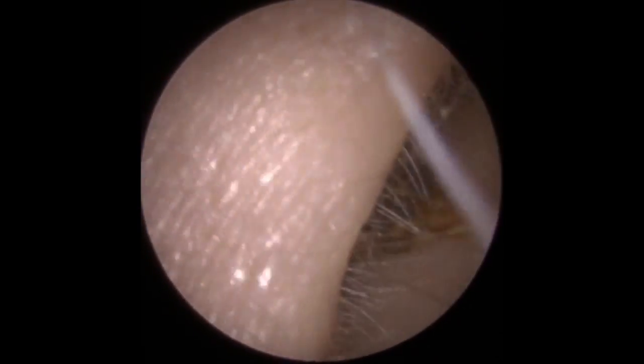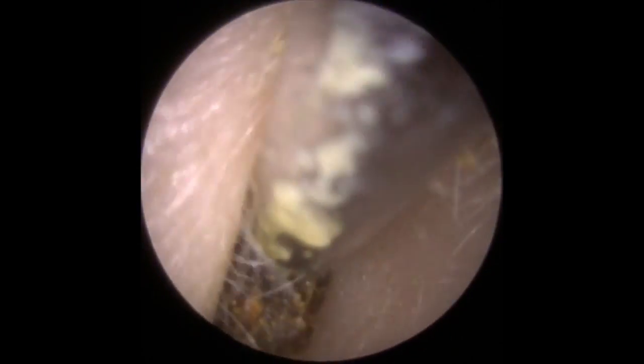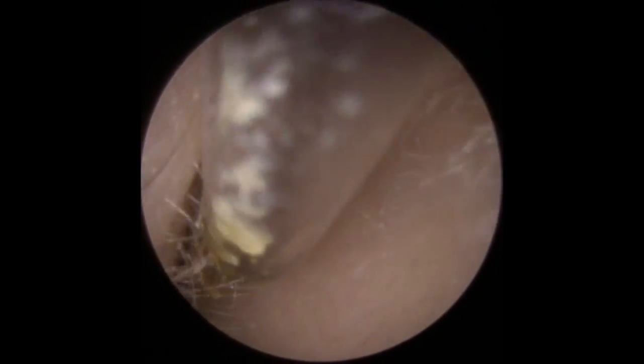Much more sticky, solid wax then. You can see it there — see the colour difference between the left-hand side of the wax and the right side? The lighter colour to darker colour there. You can see it becomes more brittle — it's dried out, oxidised a little bit more. So we've ended up with this much more sticky wax which is bound together. That's a nice big piece of it there. You can see that much darker, harder colour there further in.